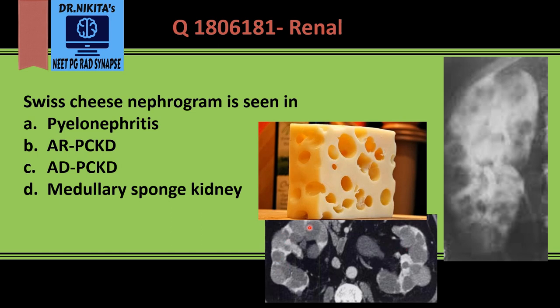On CT scan we see hypodense cysts that give a filling defect on the nephrogram. On this IVP image, within the kidney we see black areas — lucent areas — filling defects due to the cysts. So Swiss cheese means multiple holes, and multiple holes means multiple cysts in polycystic kidney disease.